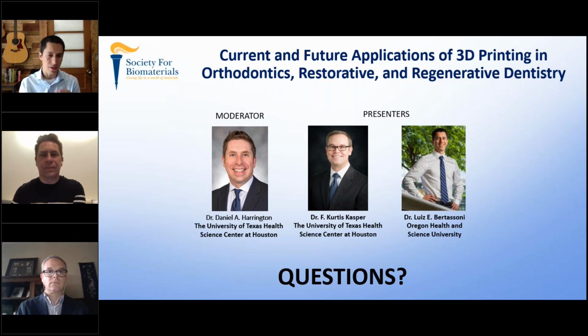So I think that the FDA specifically is being a little bit careful as far as how they regulate that for intraoral use. And right now, the biocompatible resins that are commercially available are still limited to long-term provisionals, which is a little bit dubious, but around a year or so max. But you have a very wide range of biocompatibility, going all the way up to essentially composite resin composition, very similar, down to more cytotoxic materials that can be used maybe for a day or two in the mouth.